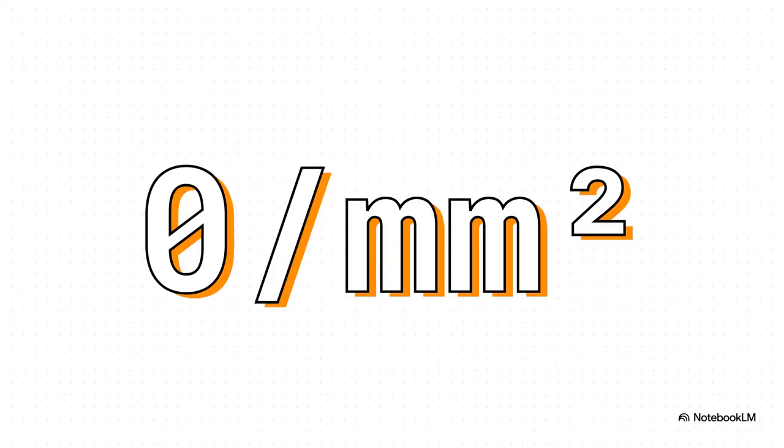So what happens if you look and you find nothing? After a really careful search of that whole square millimeter, if you come up empty, your report needs to say that loud and clear: 0/millimeter squared or none identified. You can't be ambiguous here.